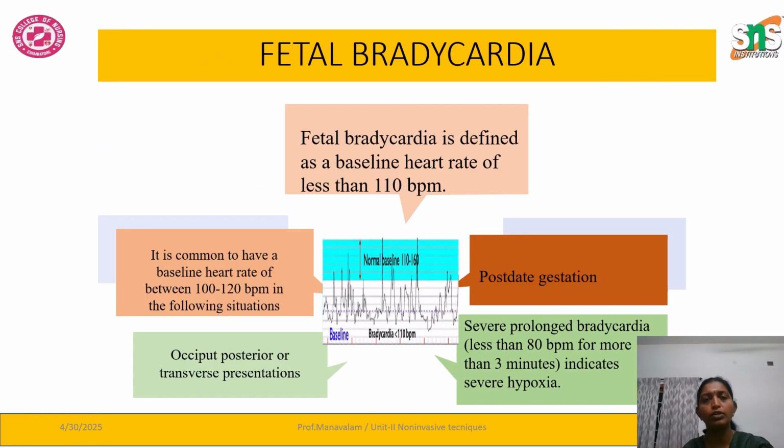Next, move on to fetal bradycardia. It is defined as the baseline fetal heart rate being less than 110 beats per minute. So this is called a fetal bradycardia. It is also one kind of abnormality.